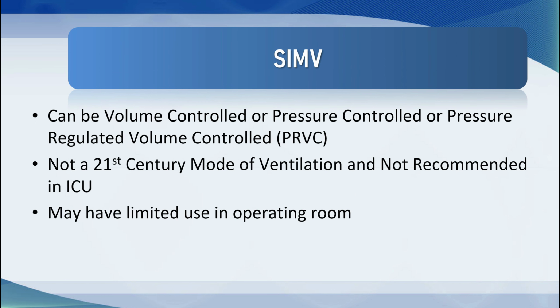Now, it is worth keeping in mind that SIMV can be volume controlled, it can be pressure controlled, or it can be pressure regulated volume controlled. That's volume guaranteed pressure control. I find these unnecessarily confusing. I'm not sure why you would want to use SIMV pressure control when there is a vastly superior version of the same mode out there known as bilevel pressure control, which I'll talk about in 2 lectures' time.